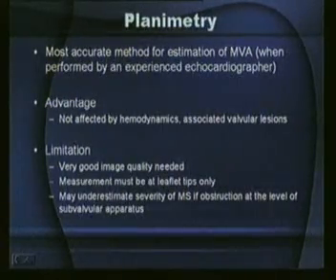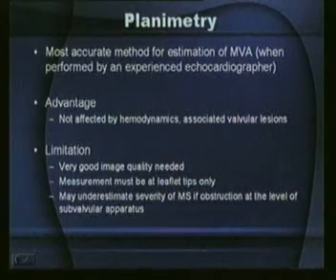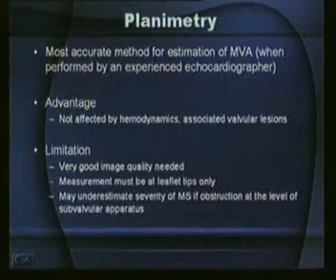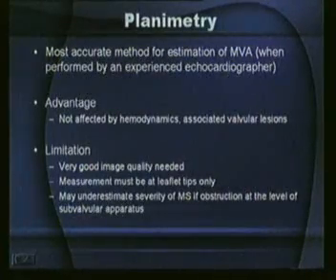Now limitations, these are not limitations, but they are just the caveats to it, that you need to have good image quality, that you must do the measurement at leaflet tips only, and this may underestimate mitral stenosis in only one condition, that the mitral stenosis predominantly is as a result of obstruction at the subvalvular level, right? The mitral stenosis can be valvular, with the commissures, and it can be subvalvular, and I'll show you what subvalvular I mean.